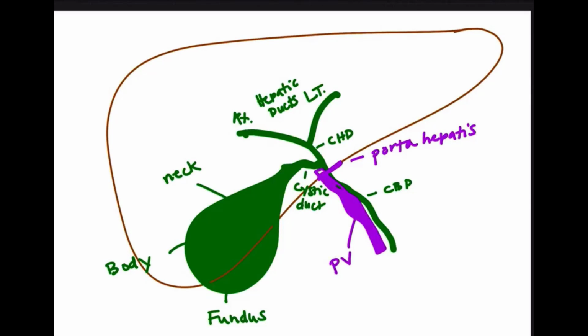Use your color to differentiate vessels and ducts. Zoom in on your image, and then obtain pictures with and without measurements, measuring inner to inner on the common hepatic duct and inner to inner on the common bile duct, showing elongated images of both.